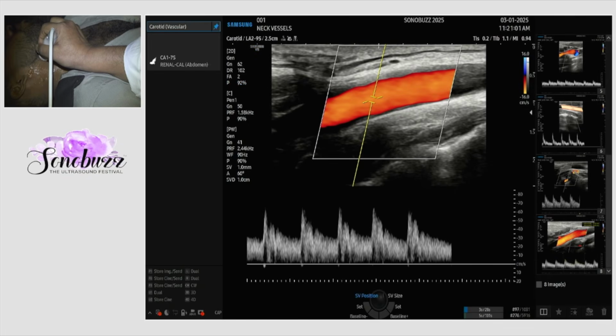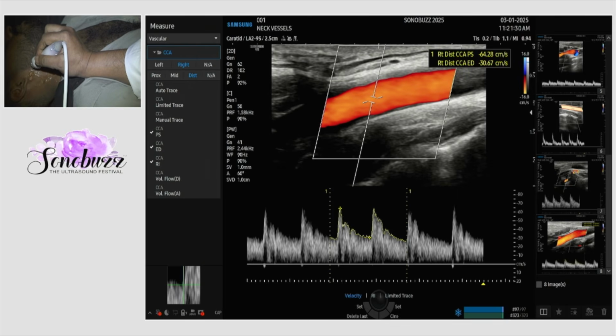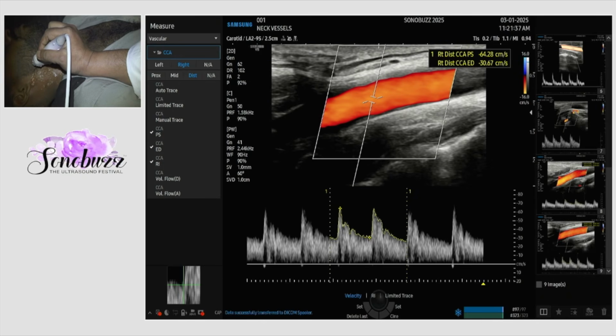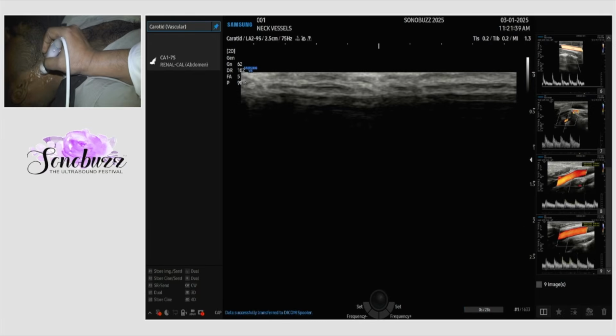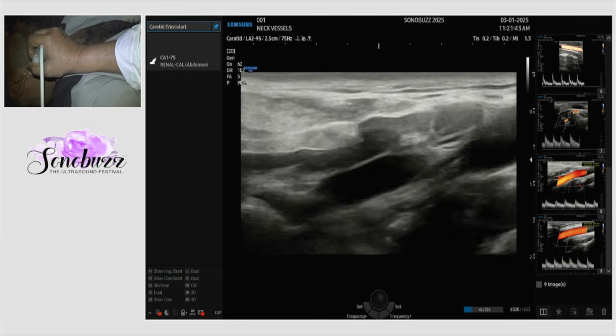While doing carotid, it is important not to give too much probe pressure, otherwise you sometimes get a spurious rise in the velocity. So it has given me the velocity here, and this will automatically calculate your ICA-CCA ratio, which you can calculate even manually later on. So these are the two things which we looked at. Now is the third artery, which is the external carotid artery.